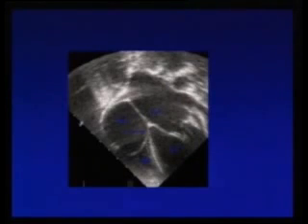You do not have to go backward. Okay, the pulmonary veins, we should look at the pulmonary veins. Here right upper, here right lower pulmonary vein you will get. Then the flap, then again the coronary sinus to define the left atria, RA, RV. This view is to show offsetting of the AV valve, meaning this is the tricuspid valve, this is the mitral valve. LA here, this is just a simple 4-chamber view for you, but the information you have to get is the hugely dilated LA and the LV.